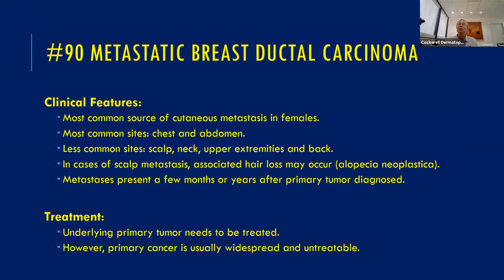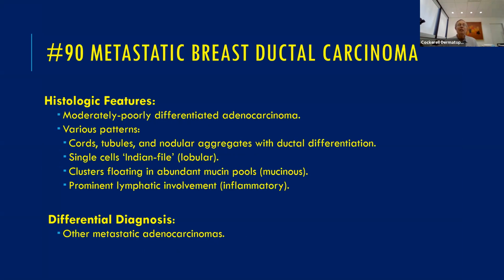They might ask some questions about what are the most common types of metastases that we see in the skin. Breast happens to be a very common one. We also see melanoma, we see squamous cell, head and neck cancers, salivary cancers, colon cancers. And some of those do look a little bit different. We're talking about the dirty necrosis in the large glandular areas in colonic cancer. They could possibly show you that and expect you to know that. But for something like this, basically just say metastatic cancer, metastatic adenocarcinoma. This happened to be breast cancer in this situation.